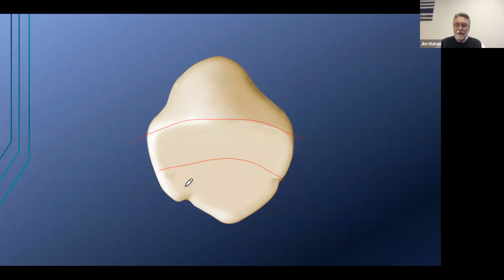Anytime you see where there's a groove, there is always going to be a depression. In most cases, we're going to call them pits. So I'm going to go 45 degrees in here, and I'm going to place a pit. I'm going to go 45 degrees in here and place a pit. At 45 degrees, if you did 1,000 teeth, it would still be 45 degrees would be the reference that you come from. This groove actually curves up in like this, and so it's not actually going to create another pit. So it does come up and establishes that right there. So those are all the pits that I have in this case.